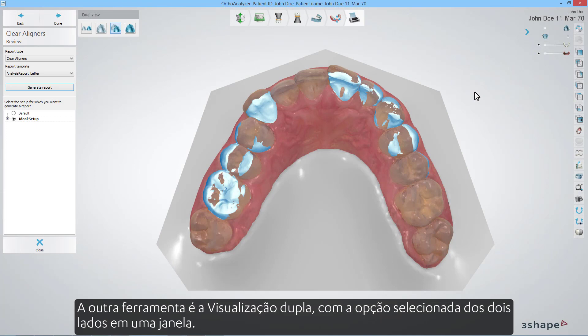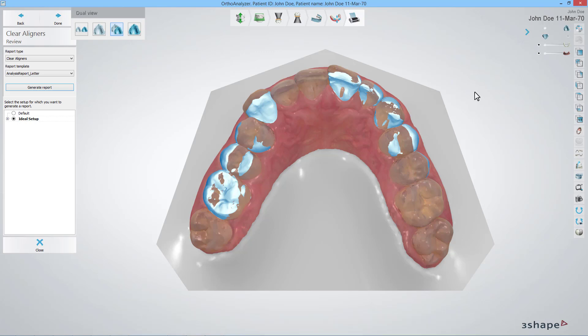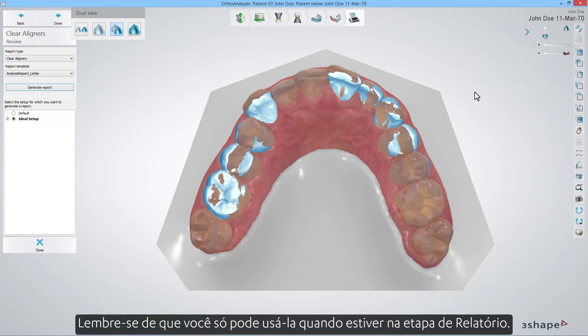The other tool is the dual view. With the both sides in one window option selected, it will show you the malocclusion overlaid on the original teeth setup. Please remember, you can only use it when you are in the report step.